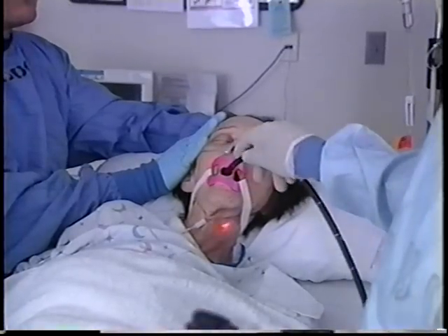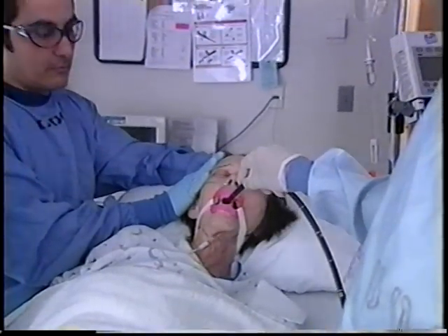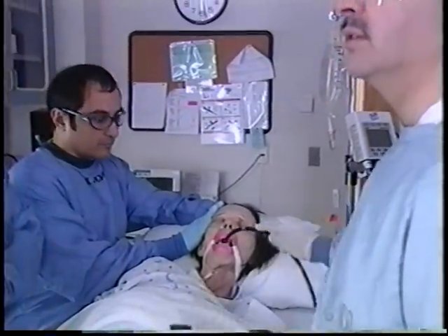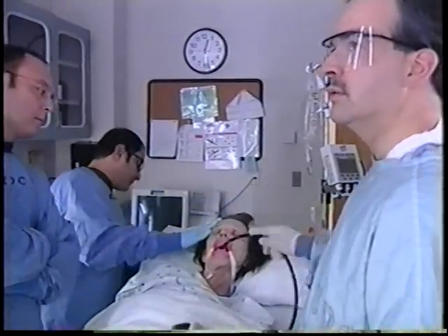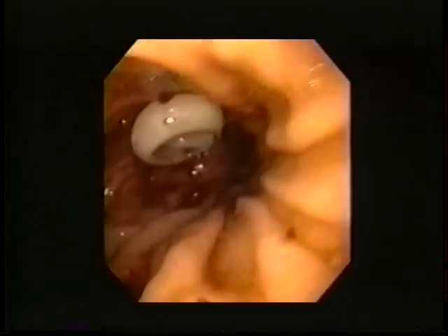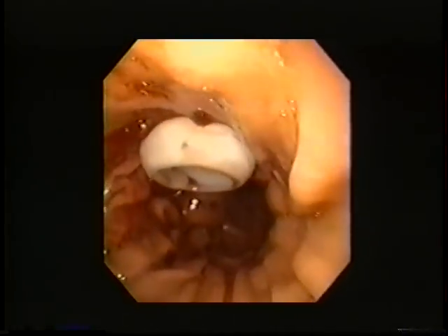Percutaneous endoscopic gastrostomy provides direct access to the stomach for placement of a feeding tube. PEG tubes are inserted using a method that utilizes the visualization capabilities of endoscopy to provide the patient with the advantages of less invasive percutaneous access. PEG tubes are placed into the stomach. A J tube can also be placed through the PEG tube to deliver nutrients directly into the jejunum.